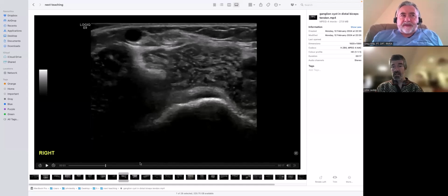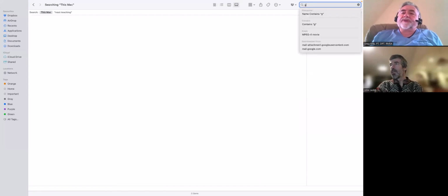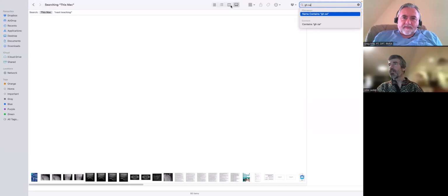Now tell me, John, you're making that judgment based on the appearance of the joint surface? Yes. And you're not seeing any hyaline cartilage, and you're seeing non-smooth cortex or a lot of osteophytes that surround the joint junction? What are you meaning by that? Let me have a look. When I'm scanning the shoulder, it's probably better to show, if I can find it, what I mean.